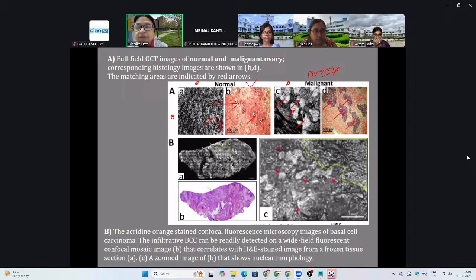Typically in a normal cell biology, anatomy and physiology course, you would be looking at ground tissue, at the ECM, the extracellular matrix, in a cartilage. In a cartilage, you'll have a couple of cells floating around and a lot of background matrix, and those are all secretions by the chondrocytes and fibroblasts.